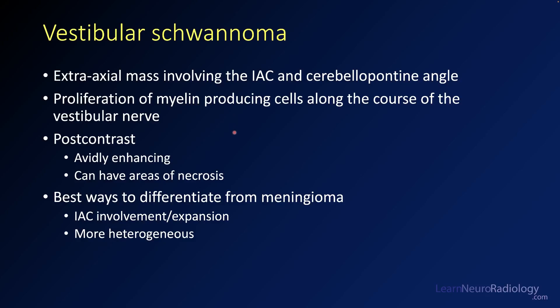On post-contrast imaging, vestibular schwannomas can be avidly enhancing and can have small areas of necrosis. Your main differential in this case is a meningioma, which can occur along the dura in those areas. The best way to differentiate them is whether there is IAC involvement and expansion, which is common with schwannomas, and schwannomas also tend to be more heterogeneous.